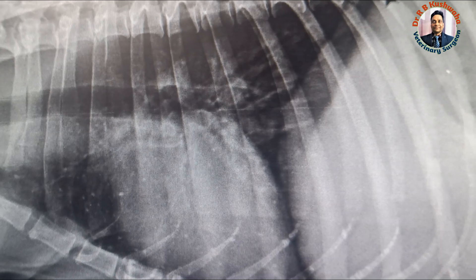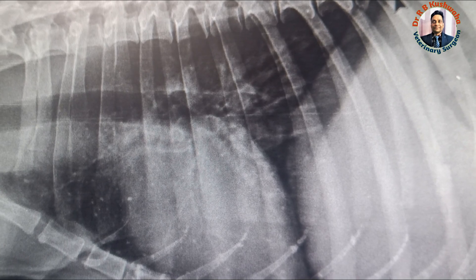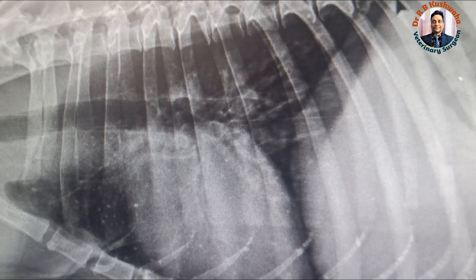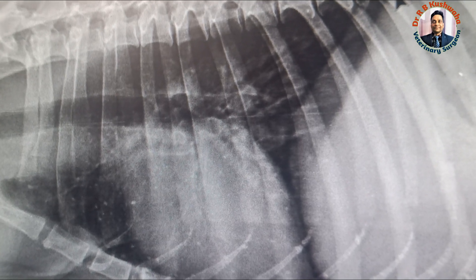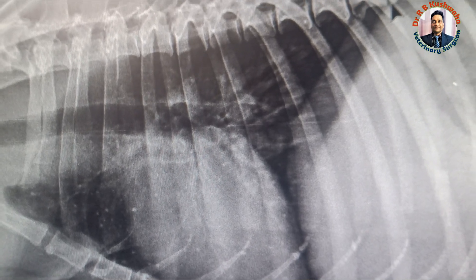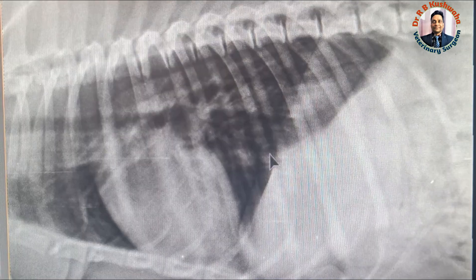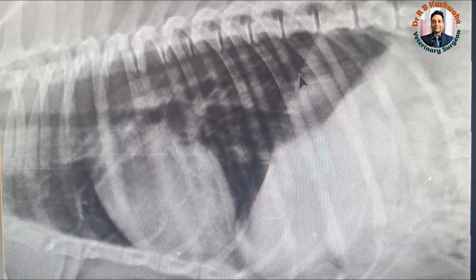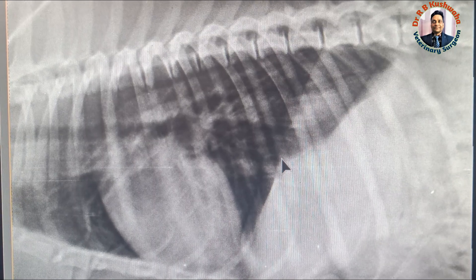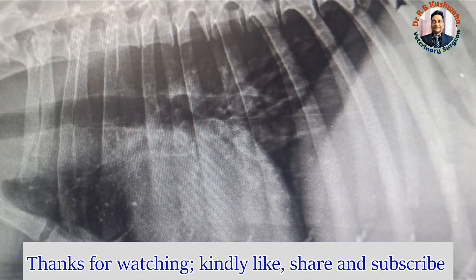By seeing the direction and position of the crura of the diaphragm, you can easily diagnose whether the radiograph was taken in right lateral or left lateral recumbency. If the crura run parallel to each other, the radiograph was taken in right lateral recumbency. If the crura cross each other at the level of the caudal vena cava making a V-shape, the radiograph was taken in left lateral recumbency. Thank you very much for watching this video.